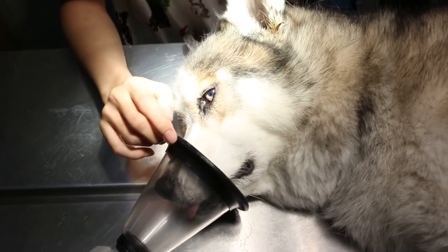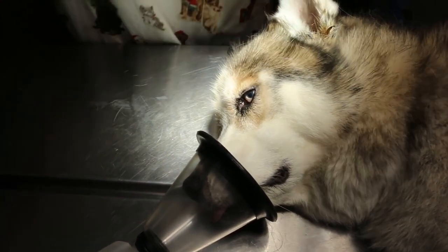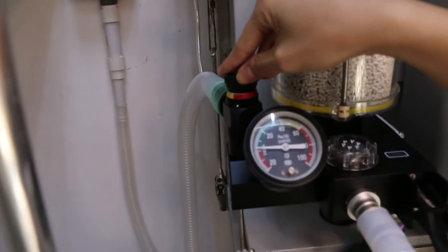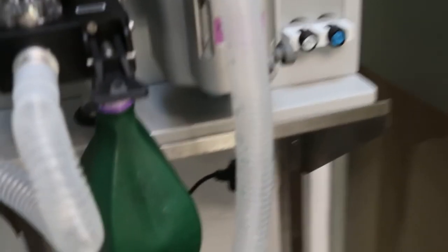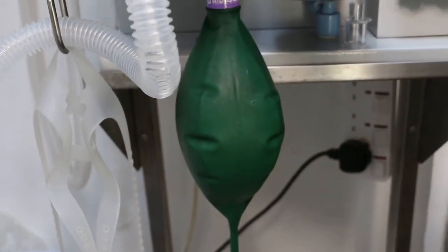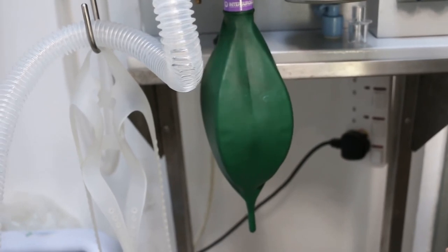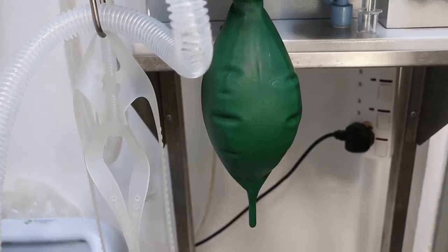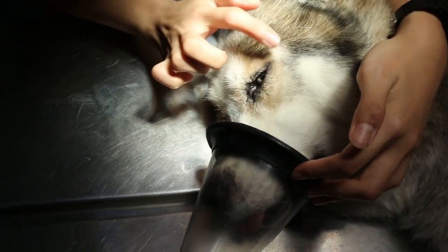I don't think it's really closed — if it's closed, the bag will fill up. Change the red valve, turn it a bit more. If it's really closed, the rebreathing bag wouldn't be moving because it would be inflated. Turn the red one to find the position where the bag stays full. At 2% maintenance, I'll just demonstrate a bit. Is the blink reflex gone?